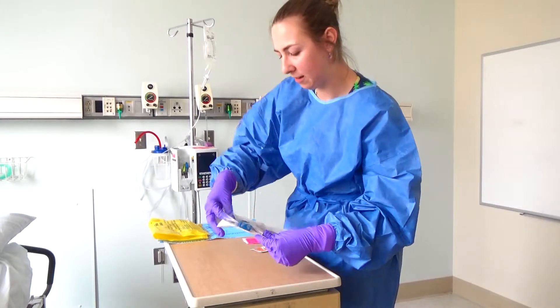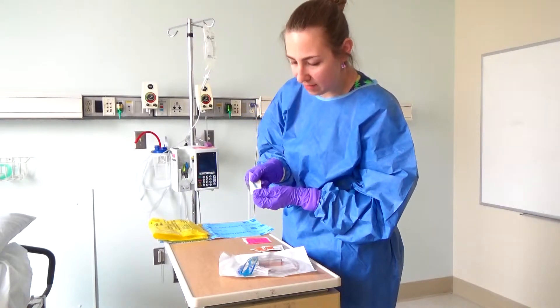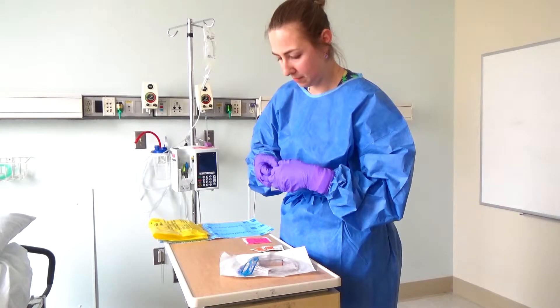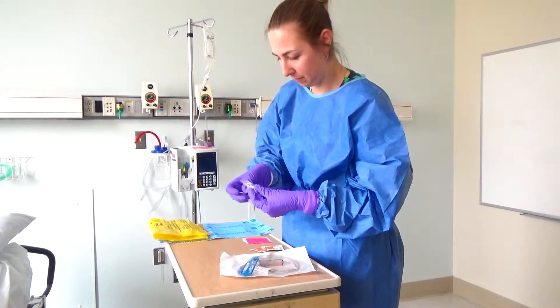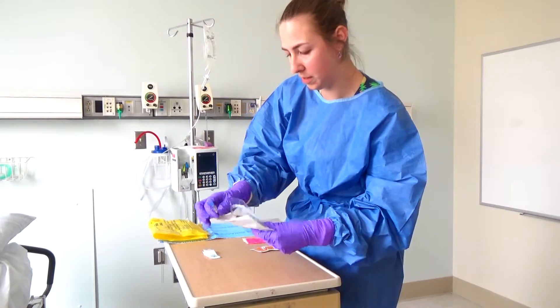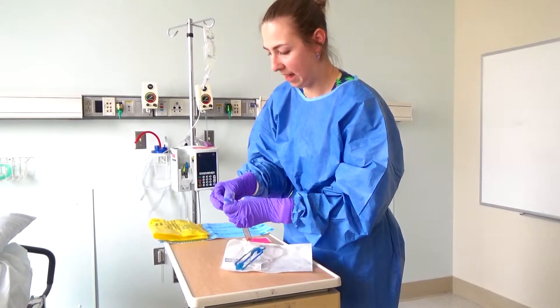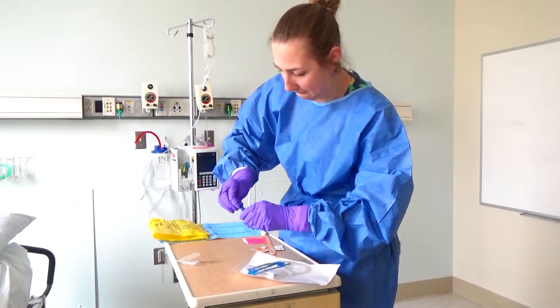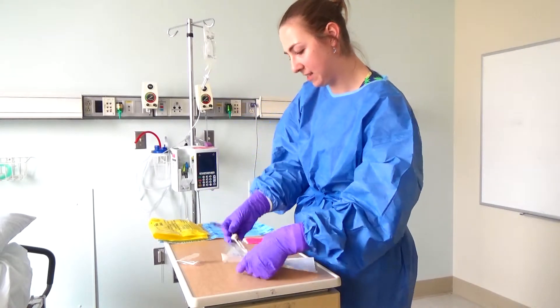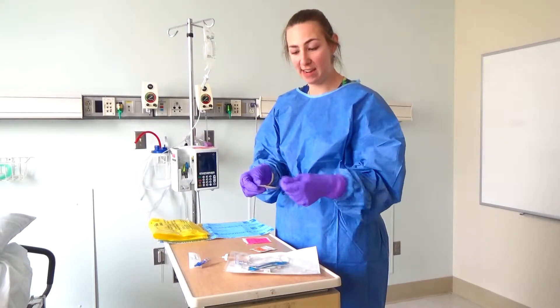There's a cap in here that I'm going to pull out. I will use this to cap the end of the tubing above the chamber. Carefully pull out the tubing above the chamber, and I'm going to cap the end with the cap provided. I like to leave this in the package a little bit before I connect it to keep the end sterile.